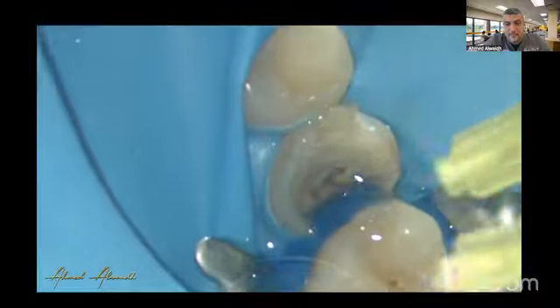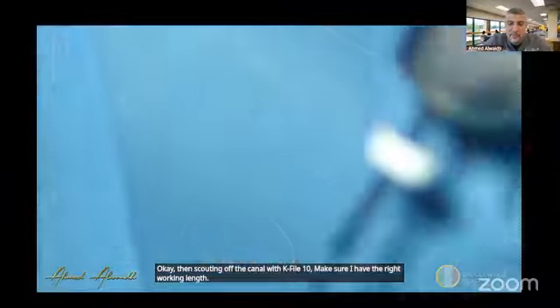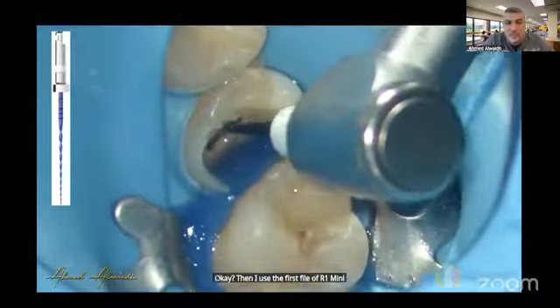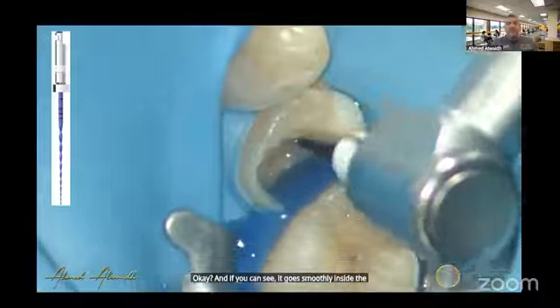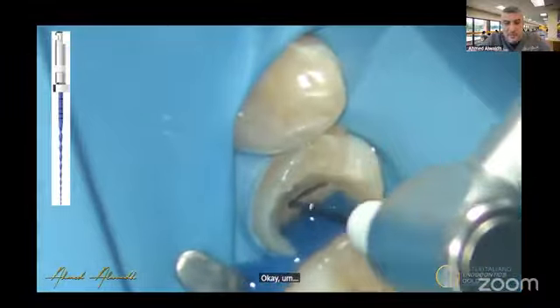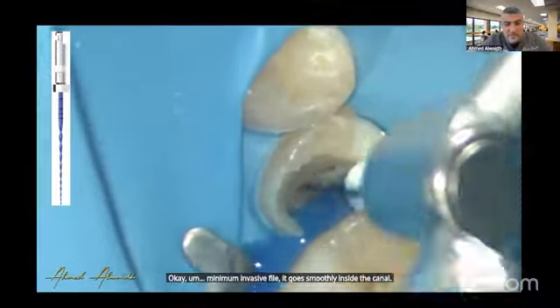Then scouting of the canal with a K file 10, making sure I have the right working length. Then I use the first file, the R1 mini, in reciprocation motion. And if you can see, it goes smoothly inside the canal. It's a very thin, minimally invasive file.